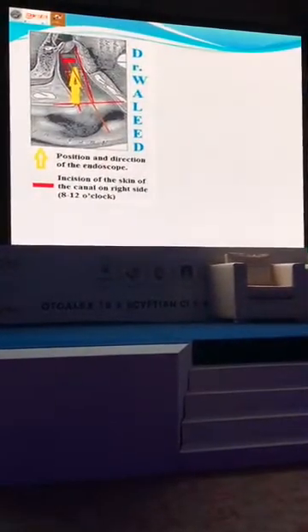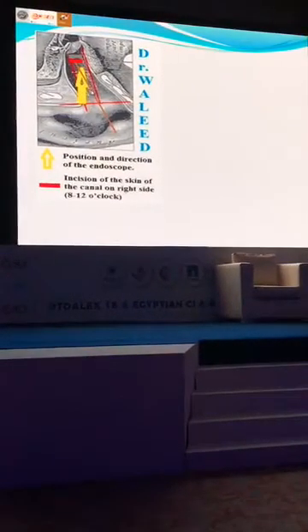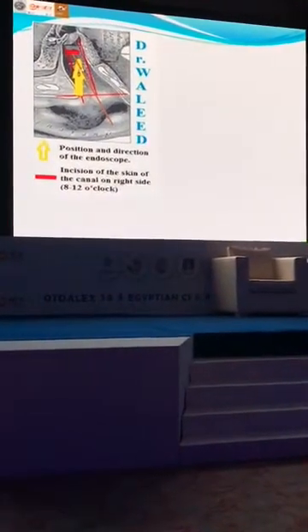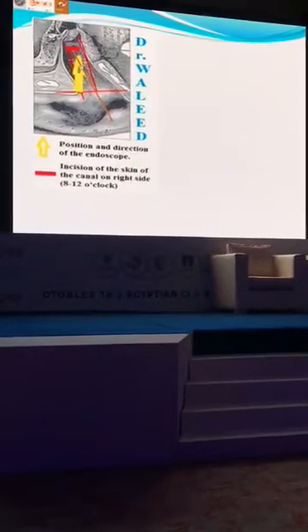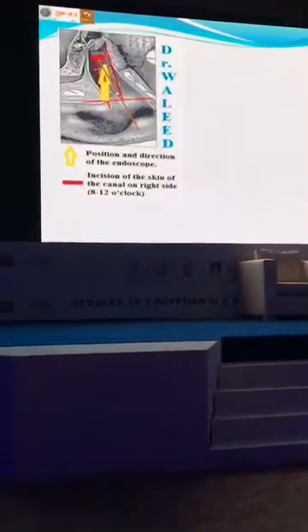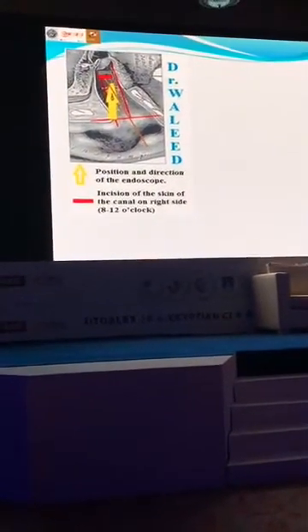The yellow arm refers to the endoscope, and the brown stick refers to the working instrument, which is here the first incision knife. Please note that there is a crossover between the endoscope and the working instrument, which makes the instrument work hard. So you are obliged to withdraw your endoscope externally to let the working instrument work with ease. This makes the vision obscured.